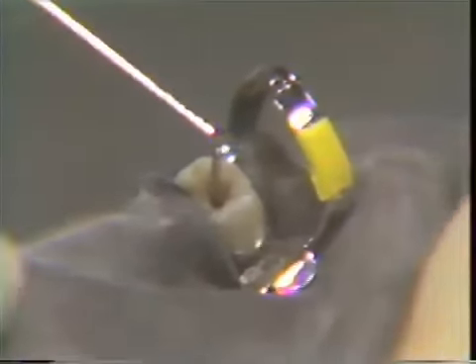A cross-sectional diagram of a maxillary bicuspid shows that if you come in from the buccal, you'll be able to have direct access right into the lingual canal. Pulling up slightly and changing the direction of the file, you'll be able to get into the buccal canal coming in from the lingual. You check maxillary first and second bicuspids this way to make sure that they have 1 or 2 canals.